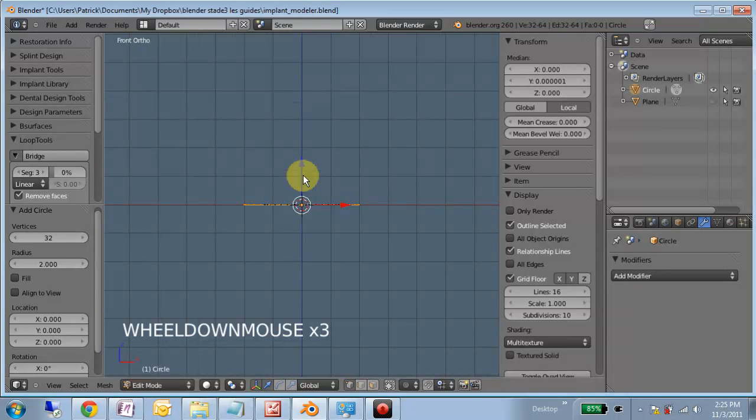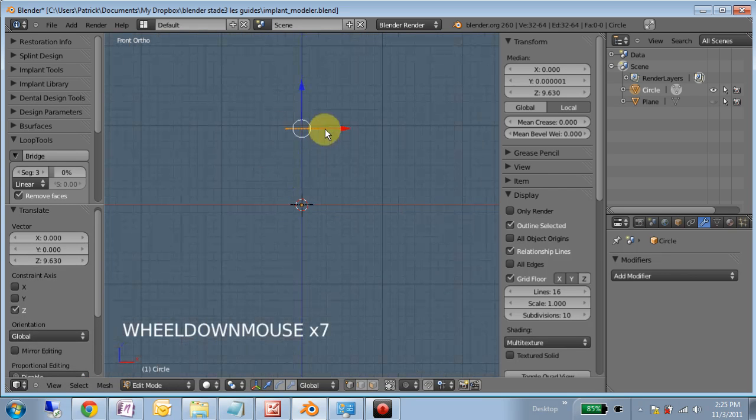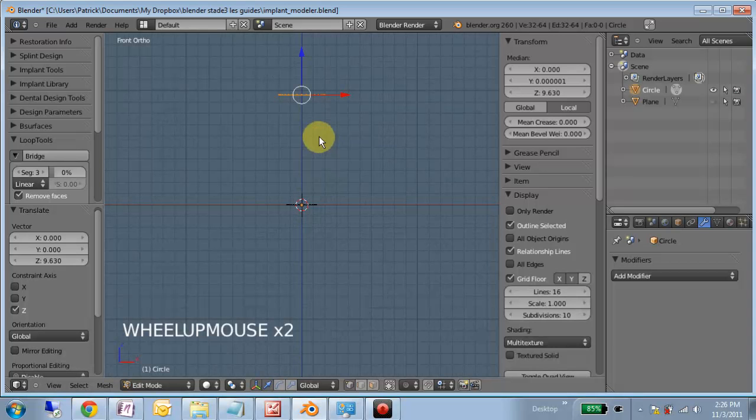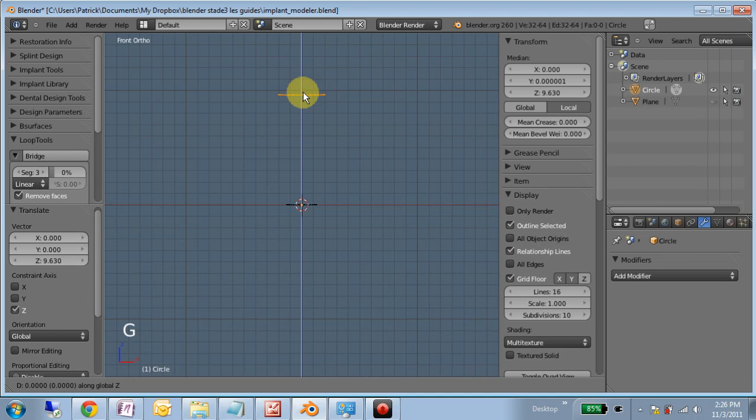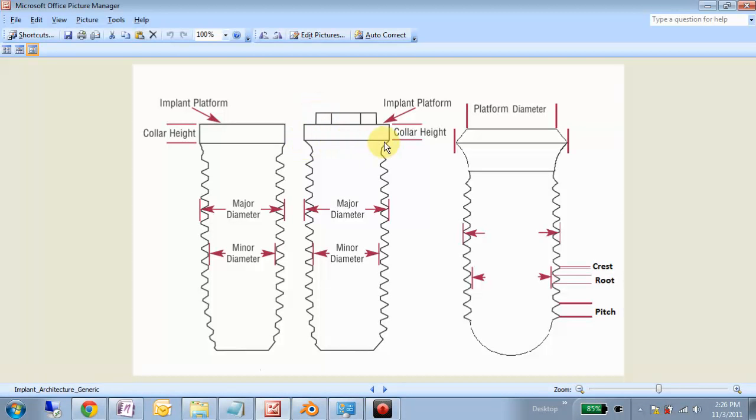And I'm going to hit G, hit Z to limit it to the Z axis and go 9.63. So that will take us all the way up here to the top of our implant collar. That's actually wrong. The implant collar is 4.1 millimeters, but I like to go up to the top, and now G, Z, minus 1. So that establishes the bottom section of our implant collar. So we're right here.